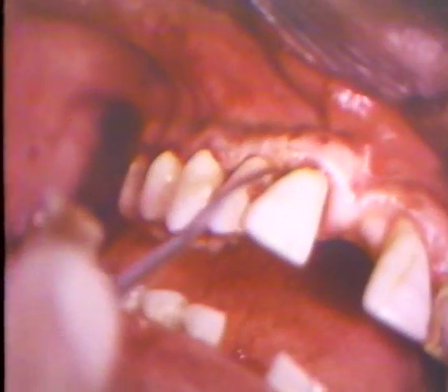It is important to remove any loose tags of granulation tissue, and here to accomplish this a Goldman-Fox number 2 curette is used. The fewer tags inside the flap, the better the healing will be. The lining of the palatal flap is now being removed with a knife, accomplished in one strip, and in other instances individual tissue fragments removed.